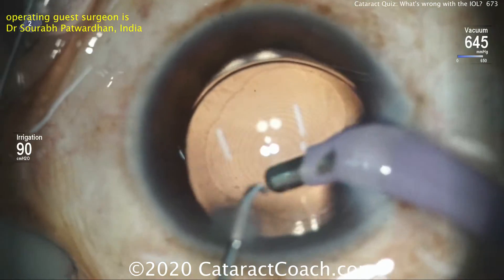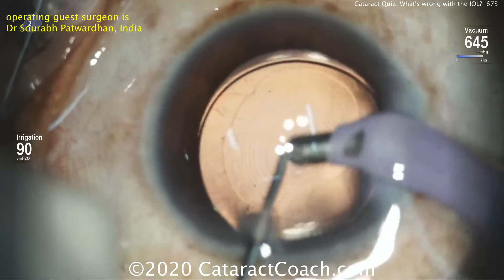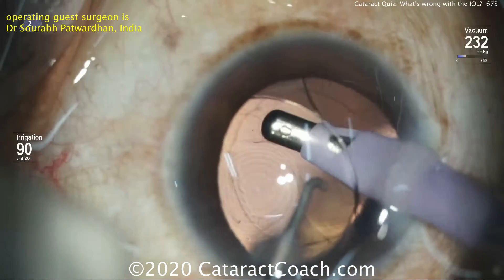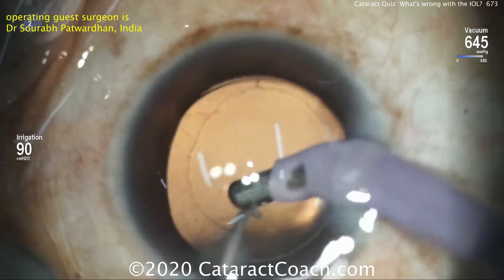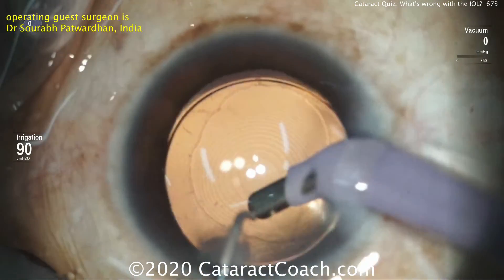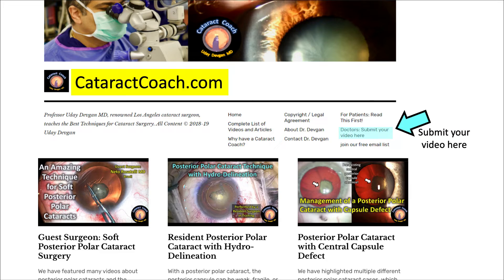With this lens having four haptics, it's much harder to decide if it's in the eye correctly. Dr. Sareb had a beautiful inclination to flip this and he was correct — this lens looks beautiful now. Try this technique if you ever get in a jam — something nice to have in your back pocket, just in case. Remember, the key of the whole case was injecting more viscoelastic to really inflate the capsular bag to give you more working room.